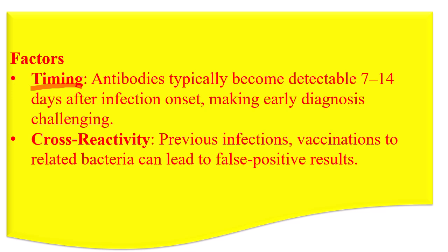If you perform the diagnostic test before the actual timing, then the result may be challenging.